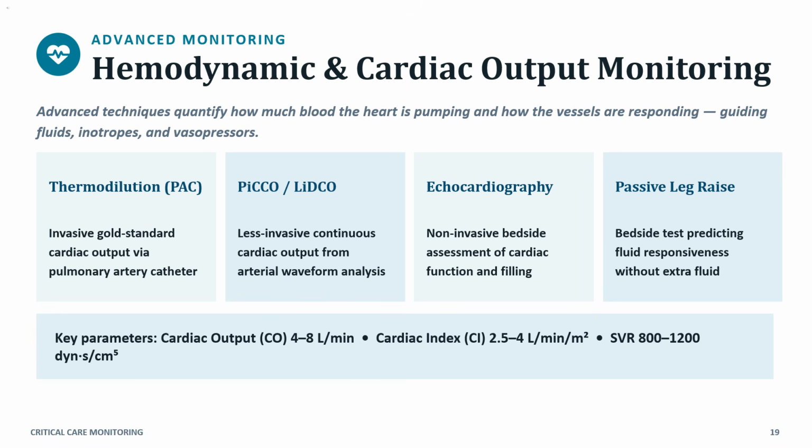Echocardiography. Non-invasive bedside assessment of cardiac function and filling. This allows quick visual evaluation of contractility, filling status, and overall cardiac performance. Passive leg raise. Bedside test predicting fluid responsiveness without extra fluid. This temporarily shifts venous blood to the heart, mimicking a fluid bolus to see if cardiac output improves.